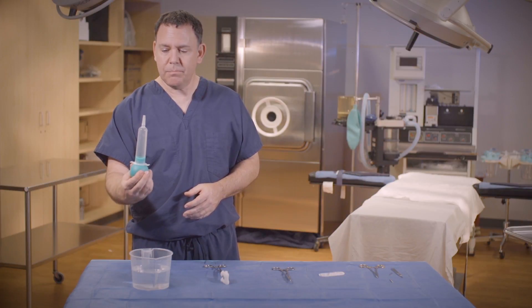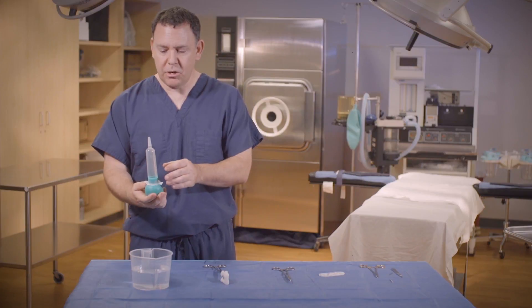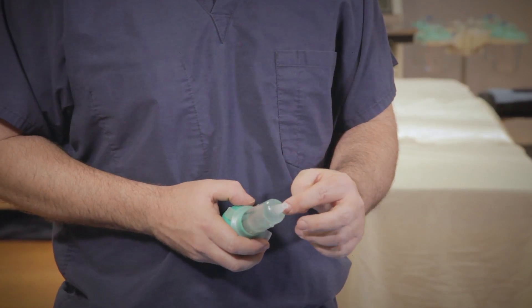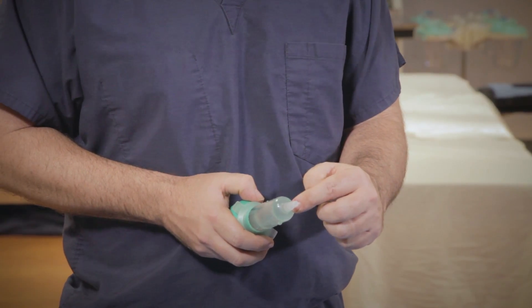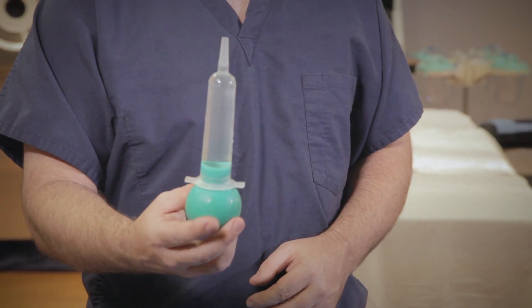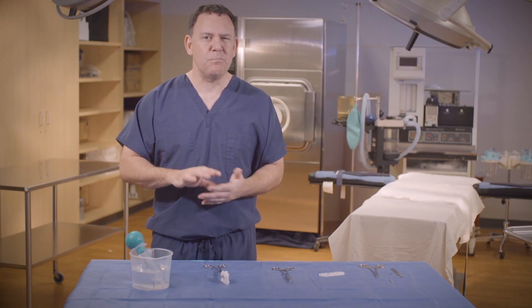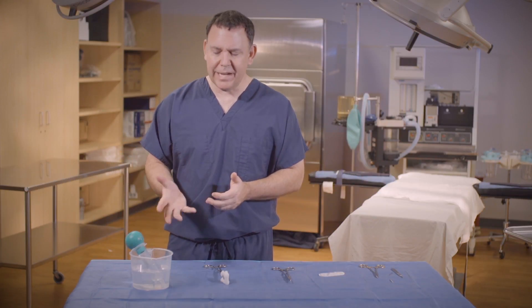Now for my students to pass this second skill test out, they have to make sure that the saline is to the tip of the Asepto. And once that is done, that's a perfectly loaded Asepto. Now bulb syringes are done in the same manner. You have to be a little more careful because you can't see the saline in the bulb syringe, but still the same steps.